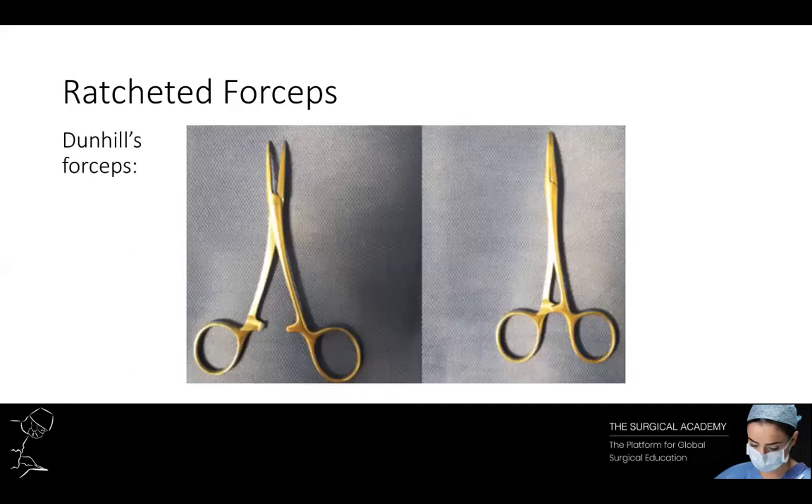These are Dunhill forceps. These are small forceps with curved serrated ends and are often used to grasp vessels prior to ligation.